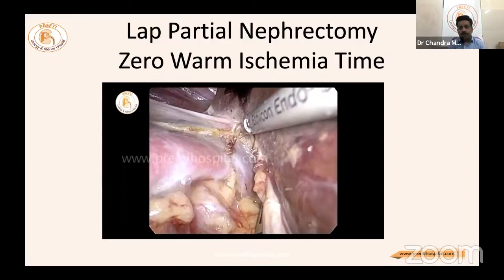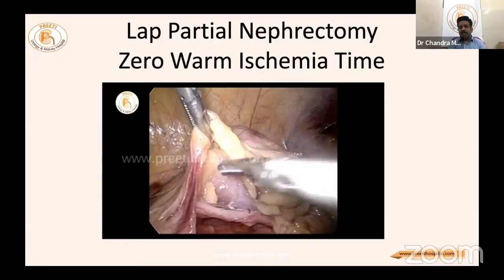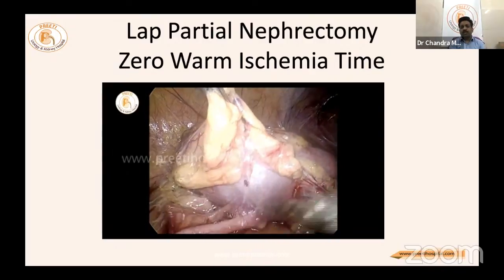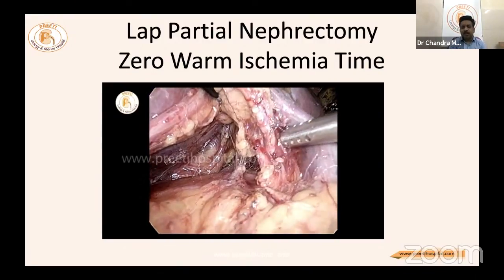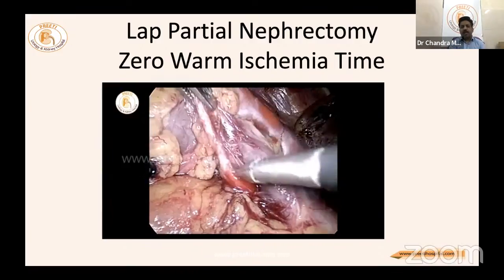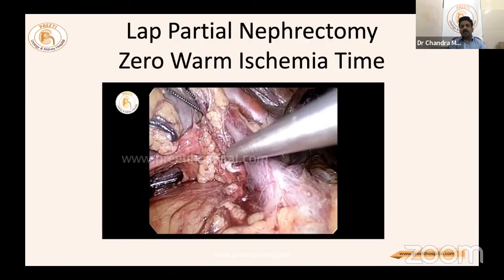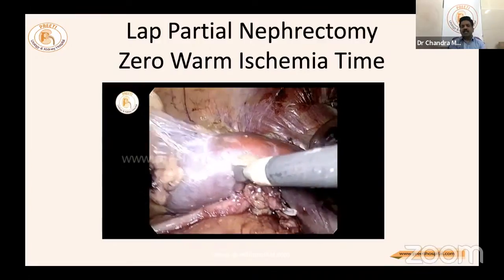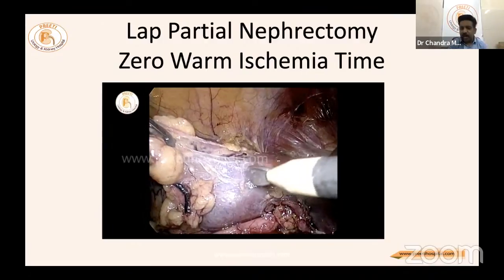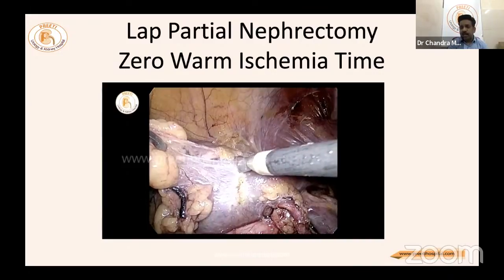The entire kidney and lower pole are separated. Stay away from the ureter — go close to the kidney surface only. The artery going to the lower pole is identified as a branch from the main artery and clipped. The tumor-bearing area becomes blue — that is the only area that needs to be resected. No main renal clamp is needed — this is zero warm ischemia time.